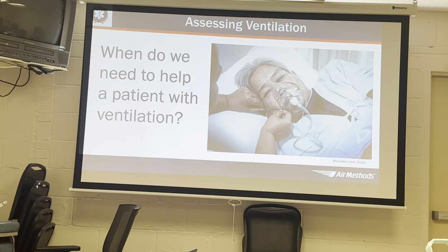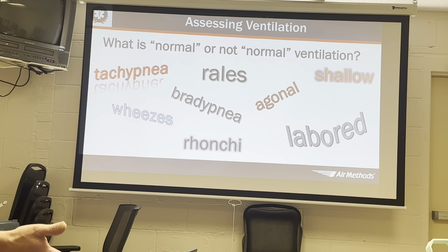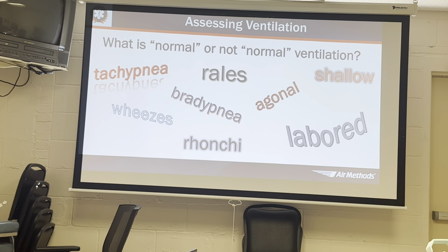So yeah, when do we need to help the patient? Basically here, whenever we have these things, we need to support them in some way, whether it be something light and simple, like 2 liters of nasal cannula, or getting all the way to the point where we're putting them on BiPAP, or maybe we're intubating the patient to help their ventilation as well.